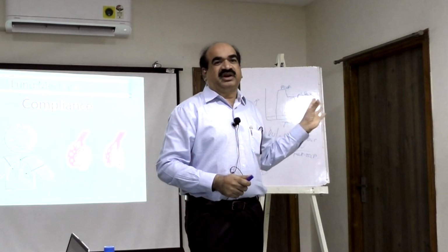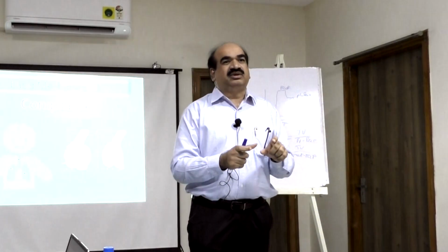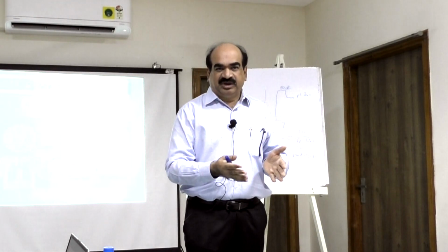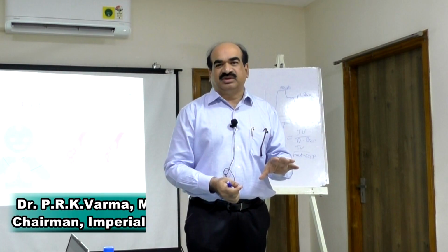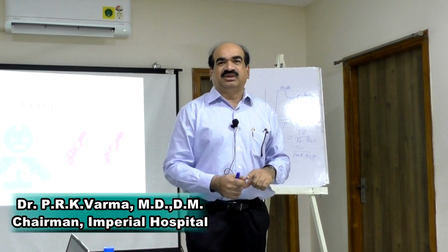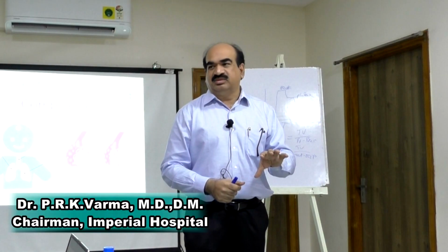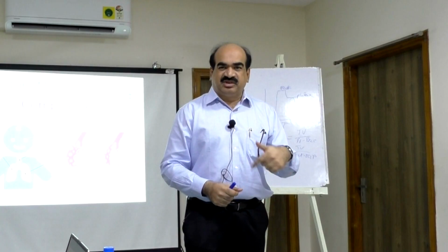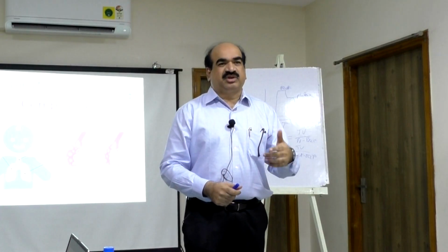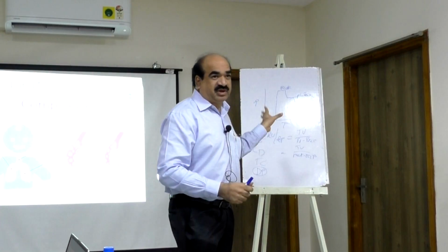Every calculation we can get at bedside by looking at scalars and loops. They are like windows to look into the mechanism of the patient's respiratory system. They are like windows, 3 front windows and 2 side windows: 3 scalars and 2 loops. We should continuously look through these windows, and we should assess the mechanics, the compliance and resistance of the patient. This is for compliance.